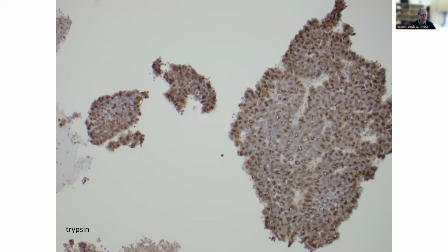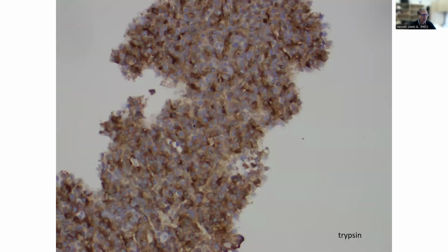In contrast, very characteristic pattern, as you see here with trypsin. And by very characteristic, I say there seems to be this accentuation around these little areas of acinus formation, as you can see here, little clear spots with generally granular cytoplasmic type staining that is incomplete, not strong throughout the cytoplasm, but certainly strong in areas of the cytoplasm.